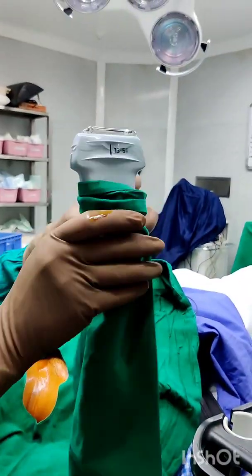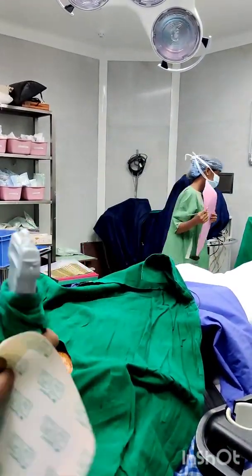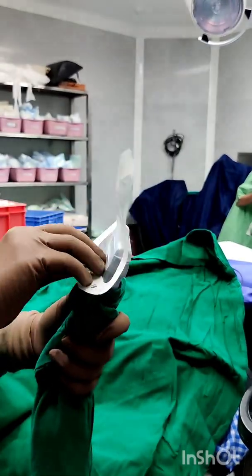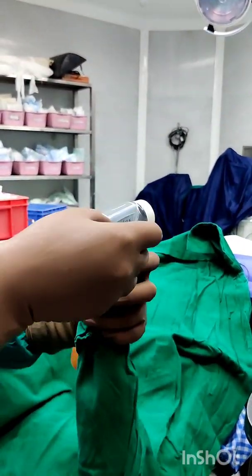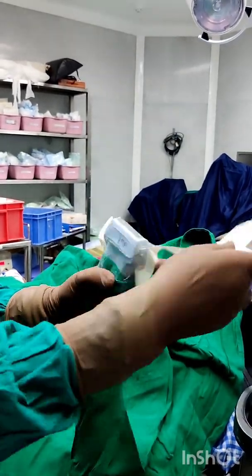The probe is prepared by applying a linear layer of KY jelly and draping the probe with a sterile short sheet and a transparent dressing. Mild sedation was given with 1.5 mg IV midazolam and 50 micrograms of IV fentanyl.